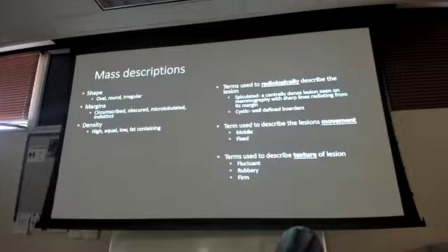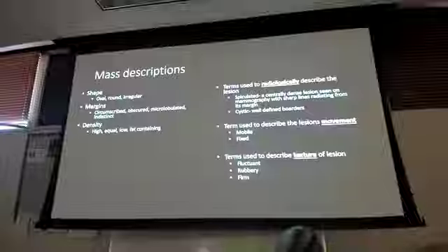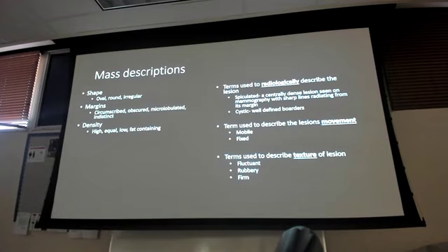So that's why it's important to do patient history, because when you put in the mammogram, there's a special implant mammogram order. That way they know what settings to use with the machine. If they were to do regular mammogram settings, then it may not be a good picture and it may hide some stuff, but they have special settings that they can do to still do the mammogram. It's helpful if you know, or if the patient knows, if it's a pre-pectoral or post-pectoral or subpectoral implant, because that will be extra information that will help them out. And we'll take a look at some pictures of that and what that looks like, so you'll see that here in a second. So what kind of things when you're talking about stuff, right?